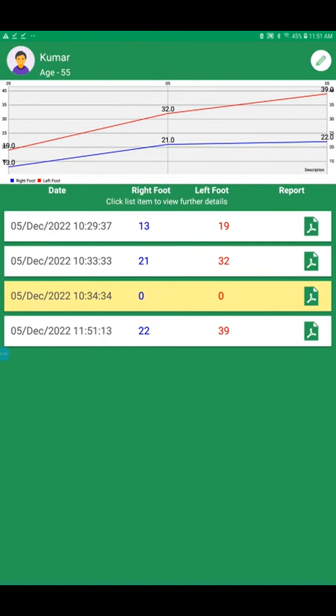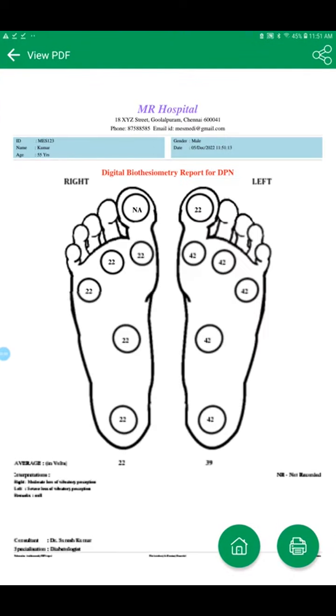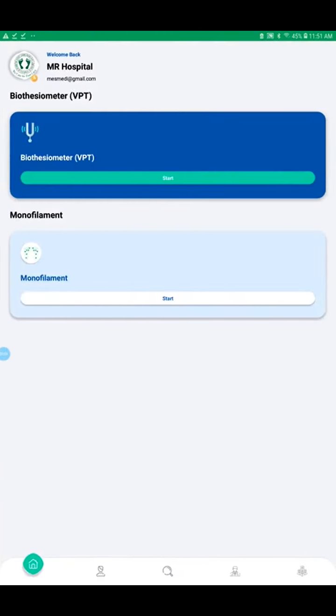Now you can view. You can see the histogram, with multiple data taken over a period. I can just select the report. The report gets printed. So I can print it or I can share it. Okay, so that's it. Now maybe I will test the monofilament.